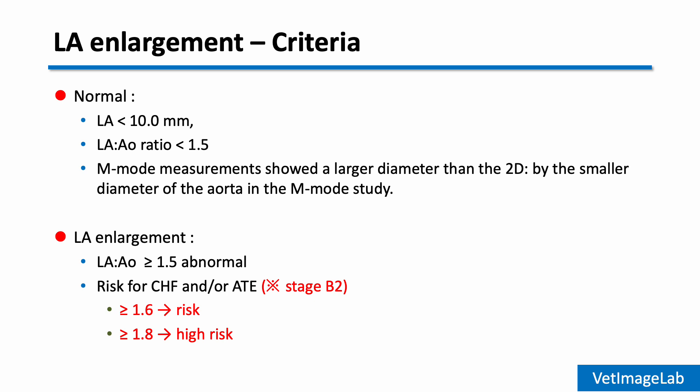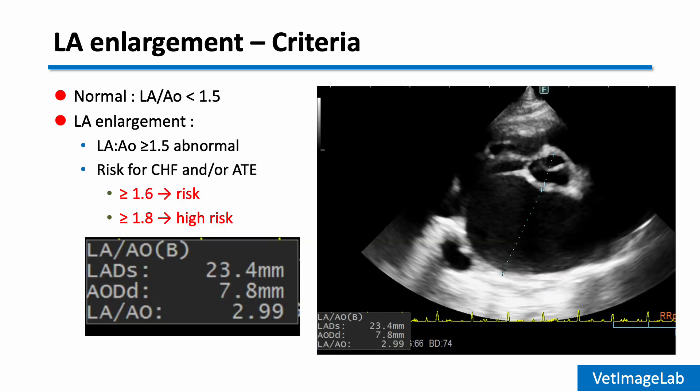Once the LA to AO ratio exceeds 1.6, the risk of congestive heart failure or arterial thromboembolism starts to increase. If the ratio reaches 1.8 or higher, the risk becomes even higher. Here's an example of a cat with significant left atrial enlargement — the LA to AO ratio is 2.99, clearly indicating severe left atrial enlargement with a very high risk of congestive heart failure and arterial thromboembolism.